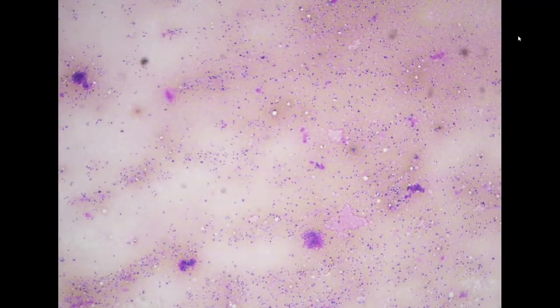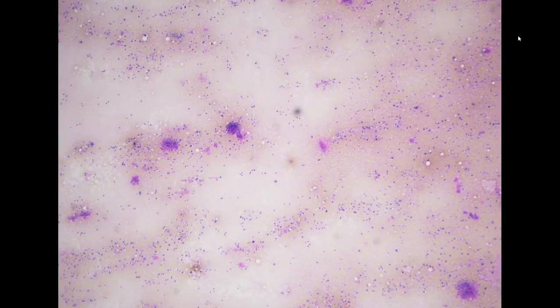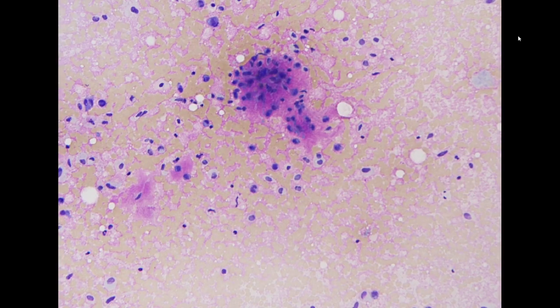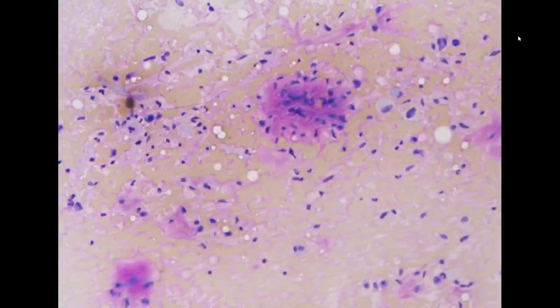Whenever we encounter pleomorphic adenoma, we usually would like to see what the morphology is on Diff-Quik. On Diff-Quik, you show the typical magenta color matrix material with fibrillary edges, and the matrix intermixes with the myoepithelial cells homogeneously.